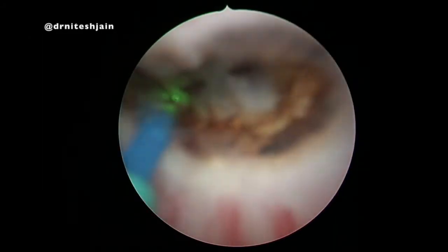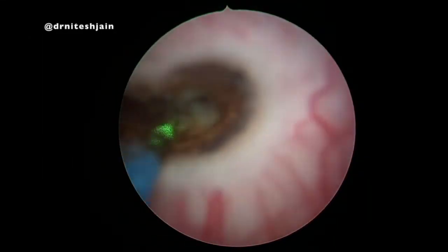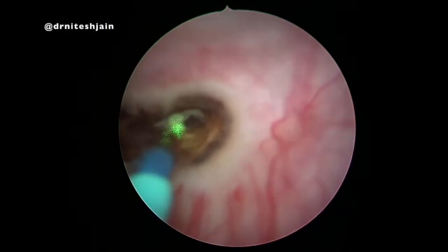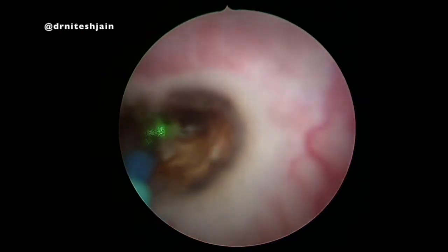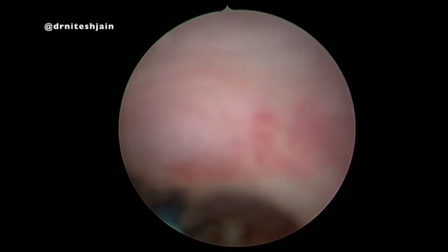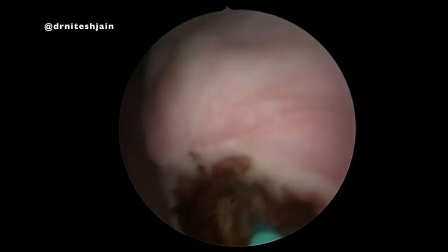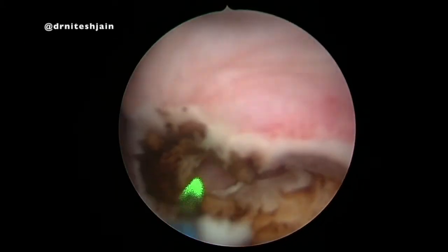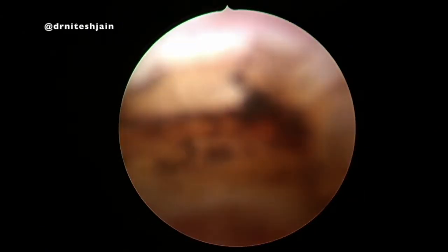The incision is deep and all around till we see a healthy posterior wall of the ureterocele. Once that is done, we can see the collapsed ureterocele and we don't have to put any stent post incision.